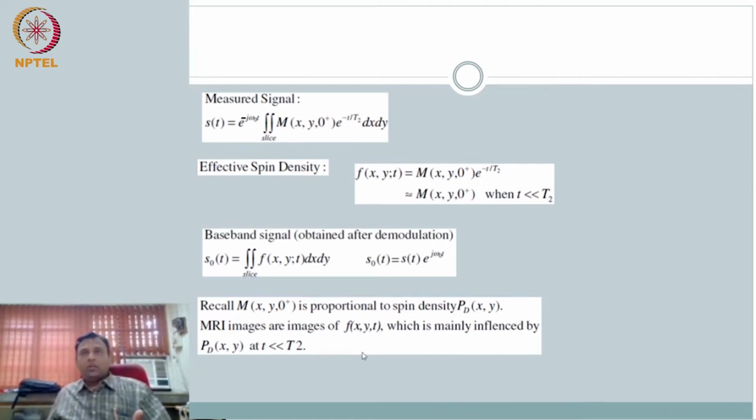So naturally you want good signal, right? Therefore you're not going to have an ideally thin, infinitesimally small imaging plane. So it's a trade-off. That is one approximation that we have done, in the slice thickness direction, but the story doesn't end here. We will have some slice thickness that gives us the best signal possible, or a signal level that is acceptable to us, and the resolution is acceptable to us.